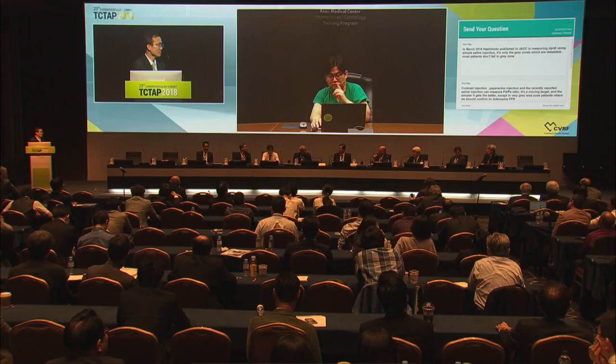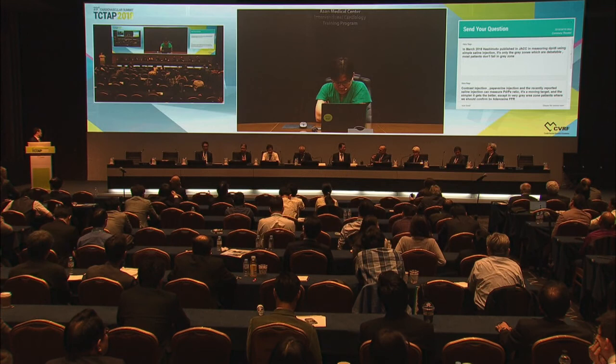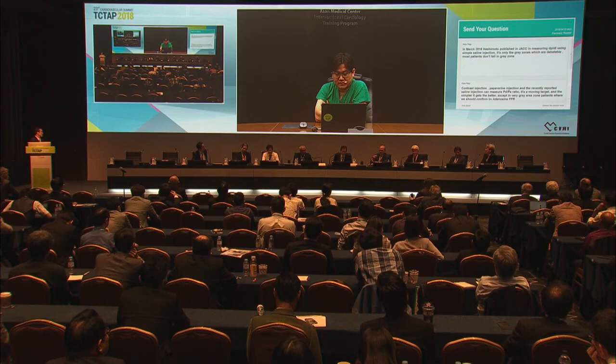I have one question, Dr. Gu. You said that IFR is a resting index, but I don't agree that IFR is a resting index. The IFR is a hyperemia-free index or adenosine-free index. Cutoff value 0.89 corresponds to the hyperemic FFR 0.80. So IFR 0.89 is not a resting status value, it mimics the hyperemia without adenosine.